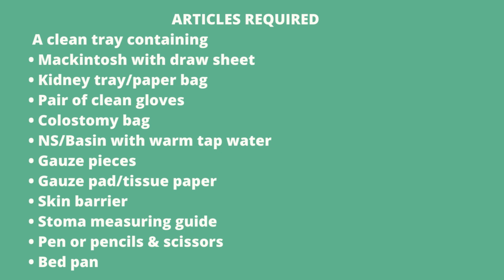So we need to mark the stoma site, and for measuring and for the purpose of knowing if there is infection or inflammation. If there is infection, there is inflammation, so the stoma site will be enlarged or inflamed. So in that condition we need to mark with the help of a pen or pencil.